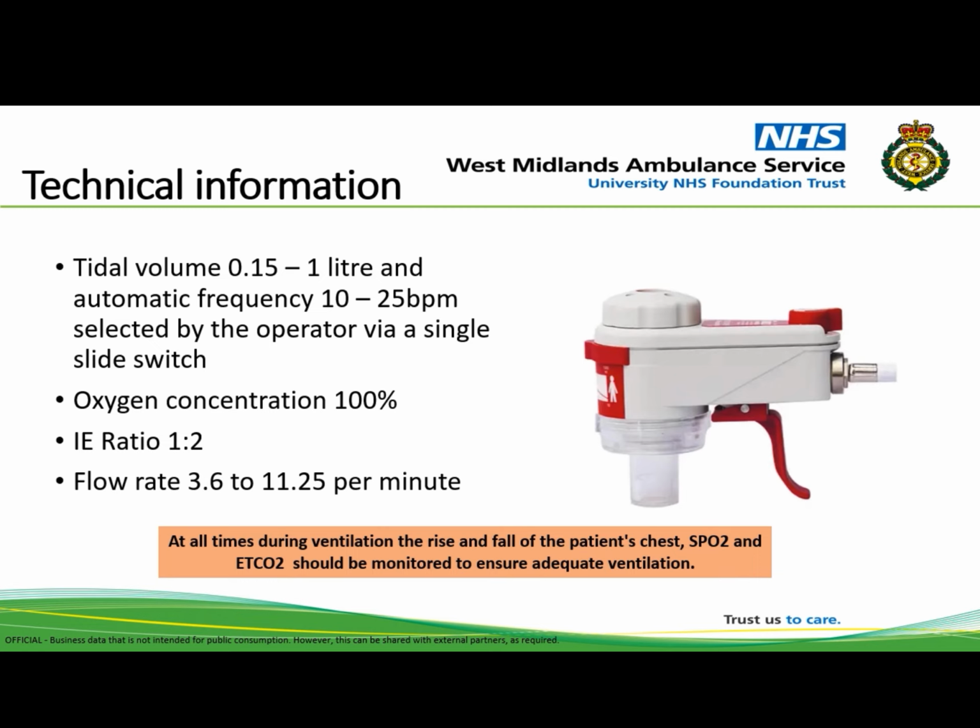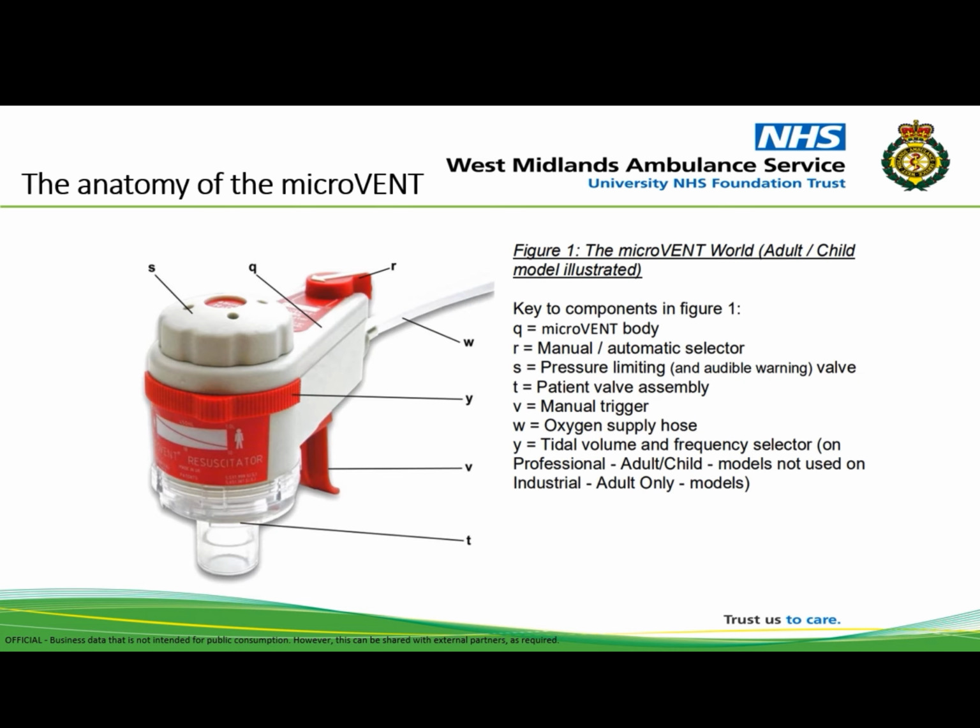It must be remembered that at all times during ventilation, the rise and fall of the patient's chest, oxygen saturations, and end-tidal monitoring should be evaluated to ensure adequate ventilation. So let's look at the anatomy of the MicroVent.